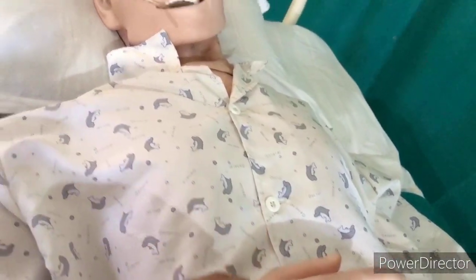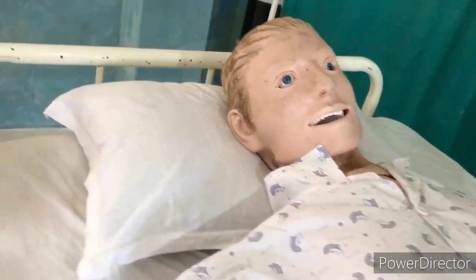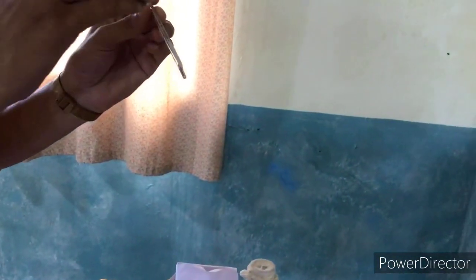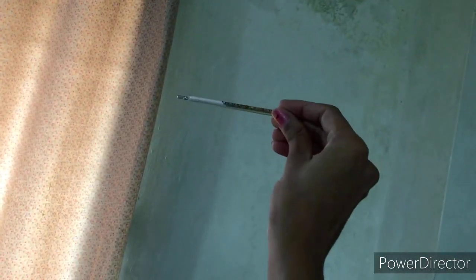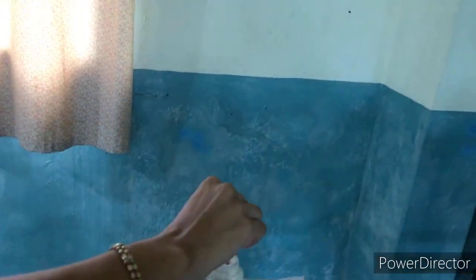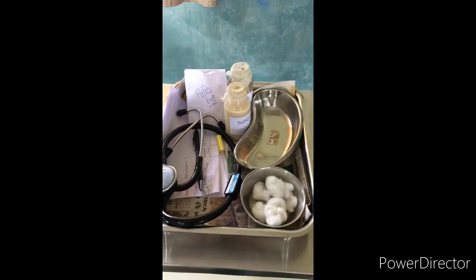Remove the thermometer after 2 minutes. Wipe the thermometer from stem to bulb with a clean cotton swab using a rotating movement, then discard it. Check the level of mercury. Return the thermometer to the container. Record all data before proceeding to take another client's temperature.